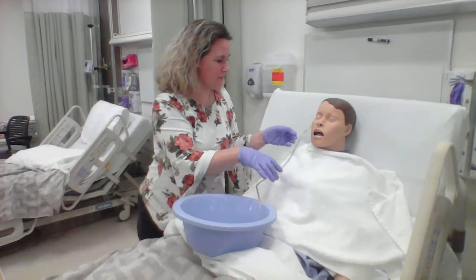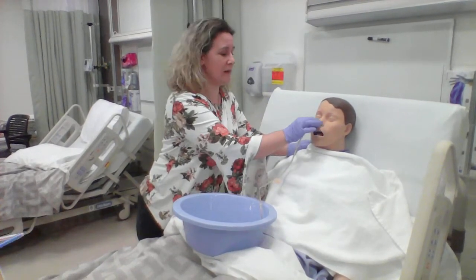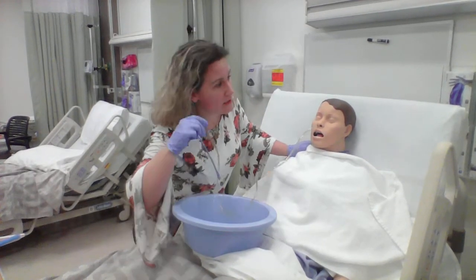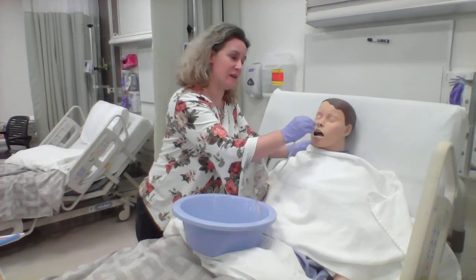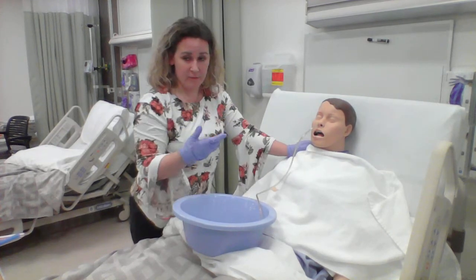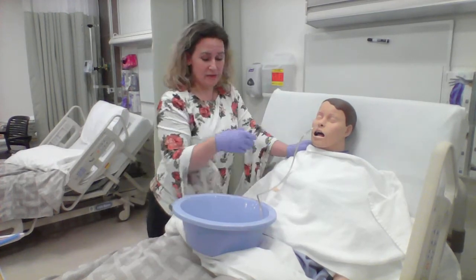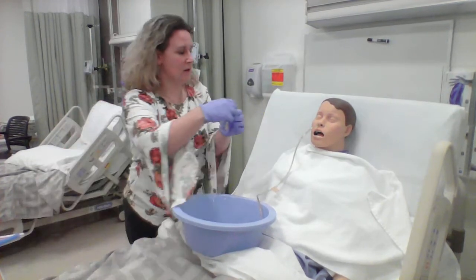Thanks, we're done with the water. If the patient was coughing, that would mean that we were at the carina, which is approaching the lungs. So I would be able to hear airflow through the end of the tube, and I would pull back, and then I would reinsert, having the patient tilt their head forward again. But we've made it all the way, and we're in the right place, so we're going to temporarily secure it on the nose.